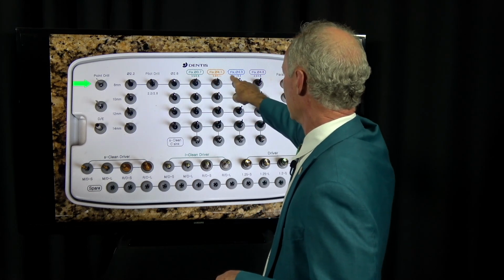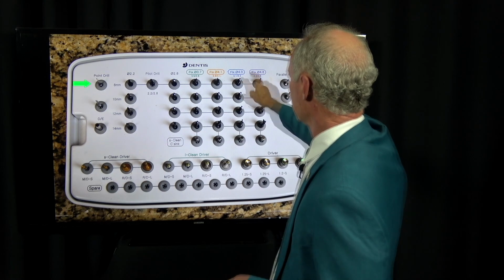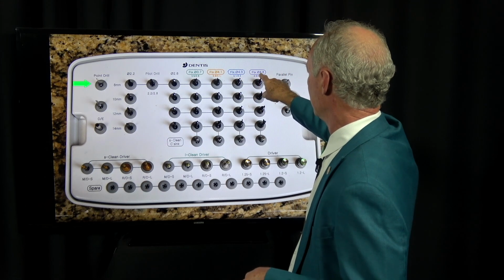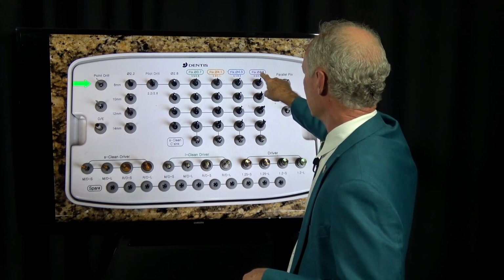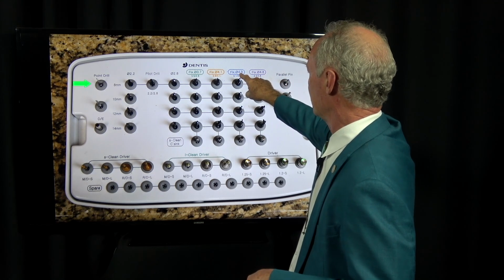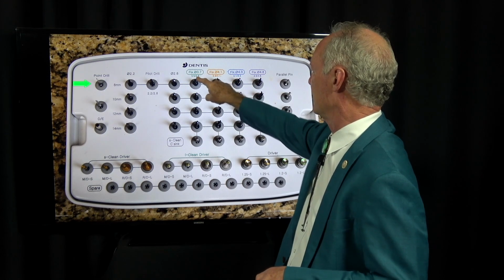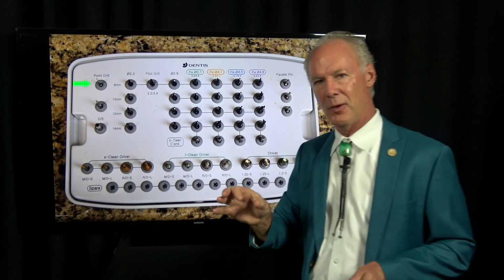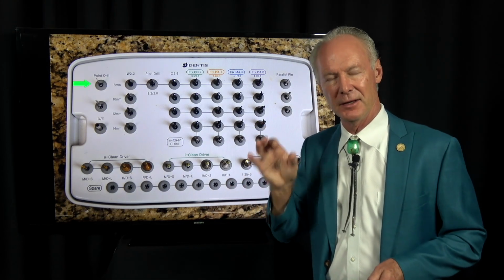and this is going to be the width of the implant. So since these are molar teeth, the width of the drill in this case would be 4.8. The width of the drill in this one, 4.3, 4.1, 3.7. You want the implant to be a little bit wider than the drill.